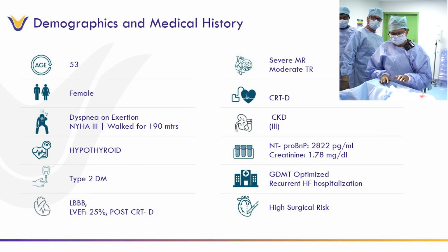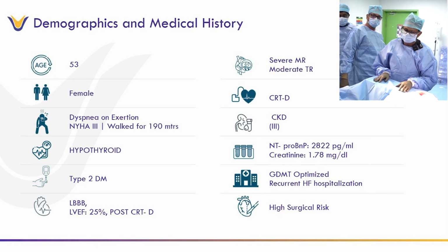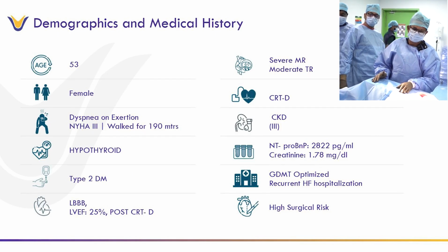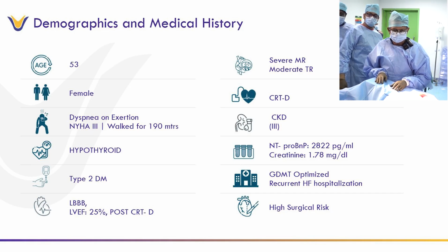Today we are doing a case of M-TEER at Tender Palm Super Speciality Hospital. I will give you the brief history of this patient. This is a 53-year-old female. This patient basically has dilated cardiomyopathy with LBBB.